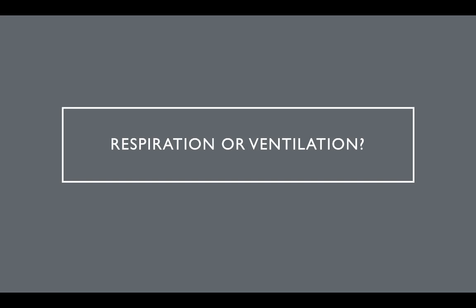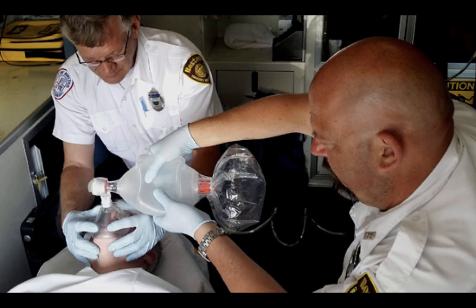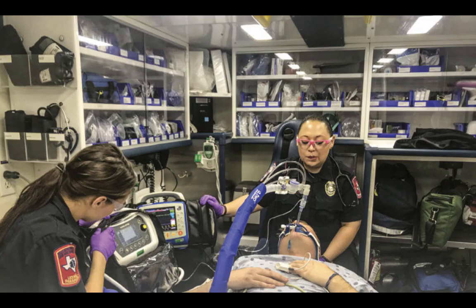Welcome. So today let's talk about ventilation versus respiration. And this gets into a question of, what are we doing? What are we doing here with a non-rebreather mask? What are we doing here with a BVM, bag valve mask ventilation? What are we doing here with a CPAP machine, CPAP setup? And oh lordy, what are we doing here with our intubated patient on a transport ventilator?